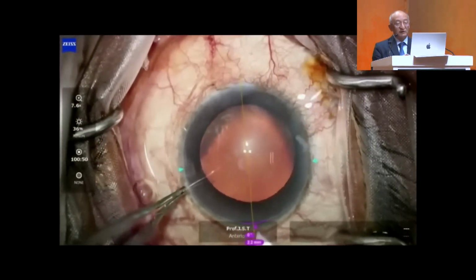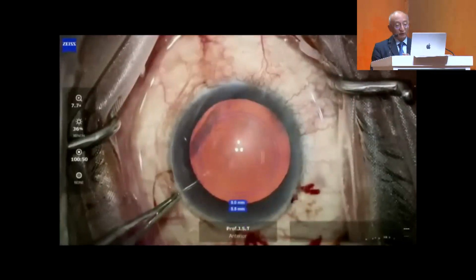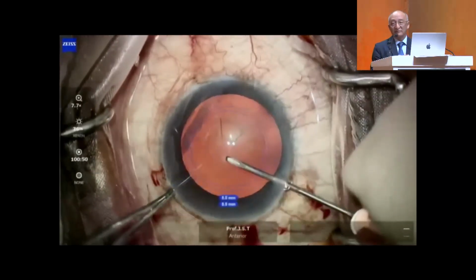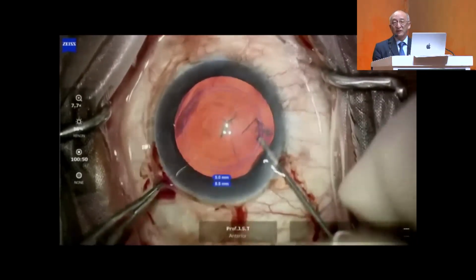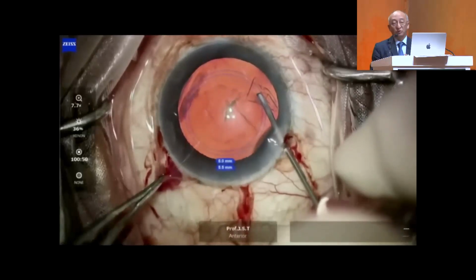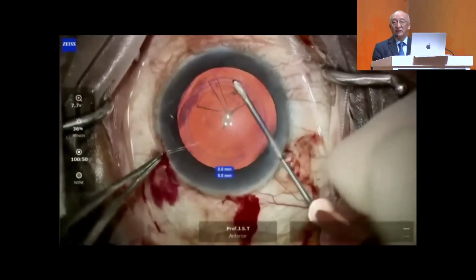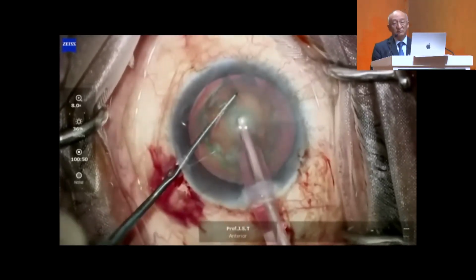So this is an image-guided surgery which I am showing, which gives you a regular area of incision always, and also gives you a guided rhexis orientation, so that your effective position of lens can be placed better. Because it is important to have uniformity in making the rhexis also, and these guidelines are always better. Many of you may be doing a marking on the cornea, and that also can be satisfactory.